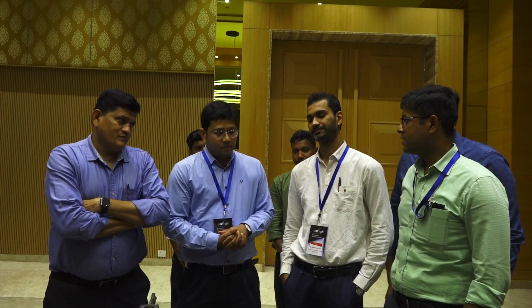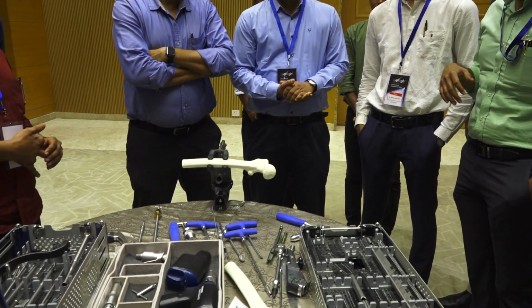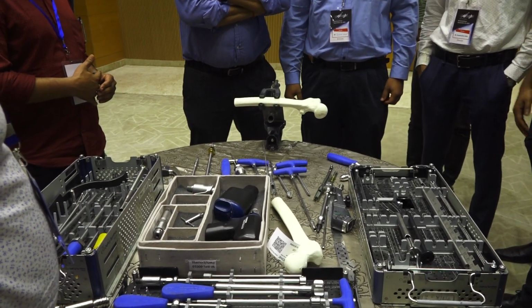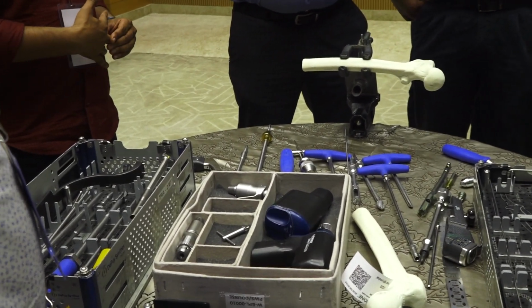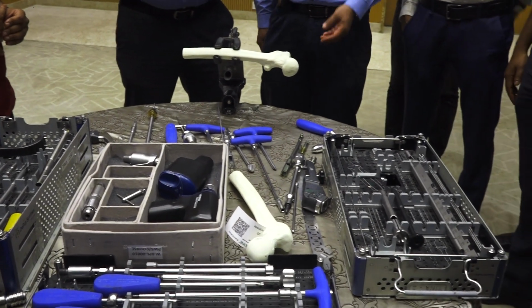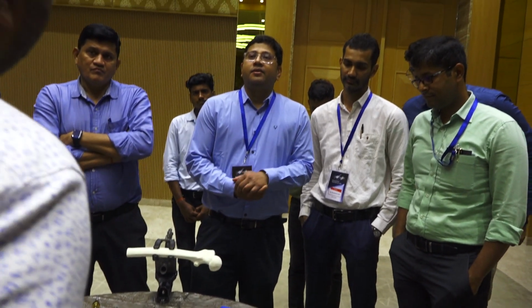But if it is about the fracture site, and you can hold the fracture fragments into one piece, and if there is a sag, you can lift it. So depending on the type of fracture and number of fracture fragments, either you can do it in a closed way or you can open it. So what are your criteria, Dr. Gopal, can you tell us what are your criteria for achieving a reduction and seeing that we have reduced the fracture with traction? So what are the things that you see?